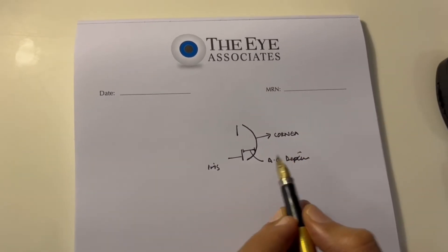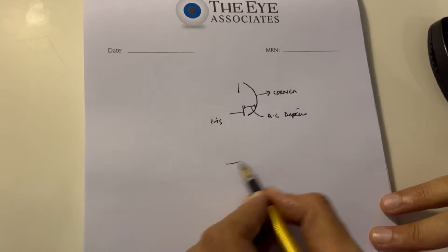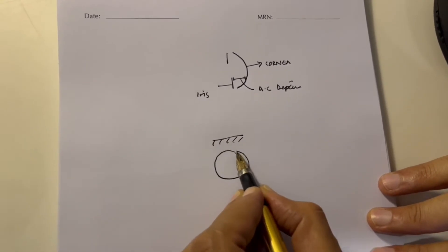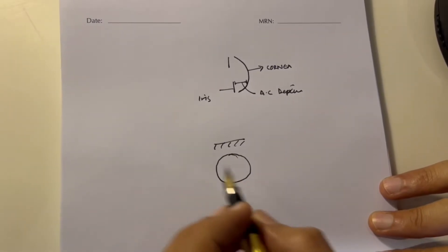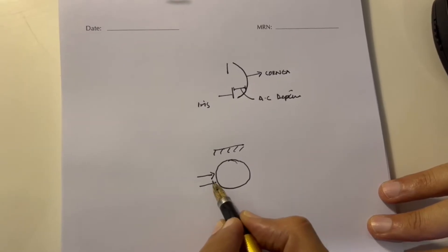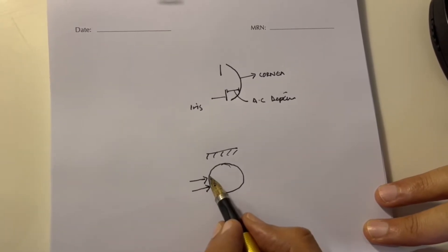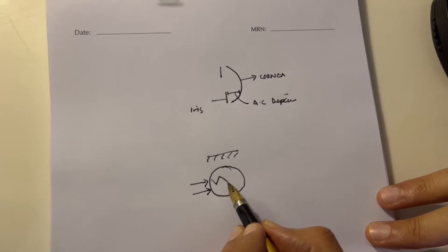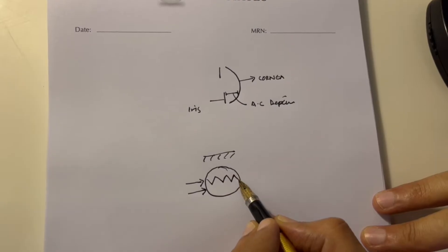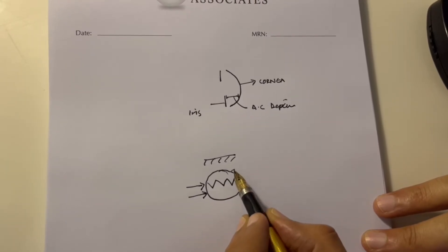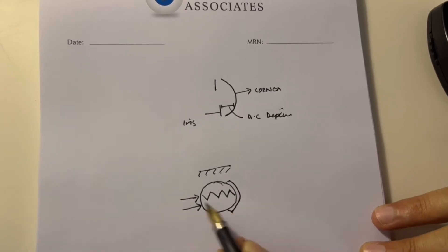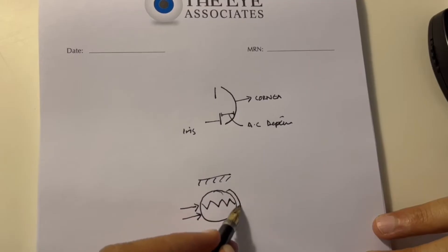The other thing you do is look at the cornea from the primary position and shine a light on the temporal limbus. The light will pass through the anterior segment and form a crescent on the opposite limbus.